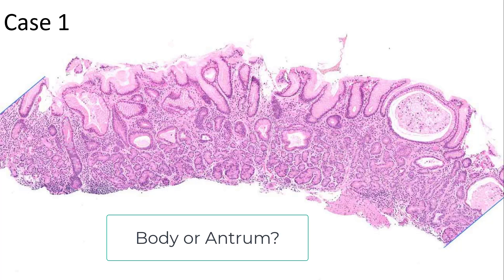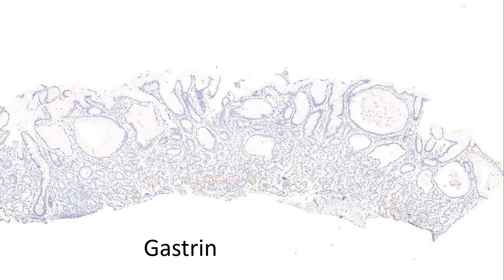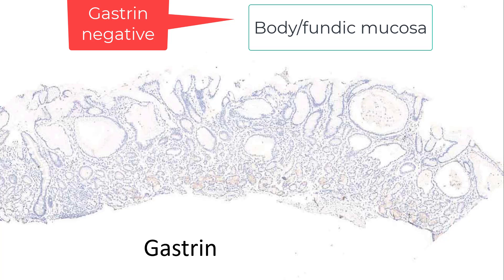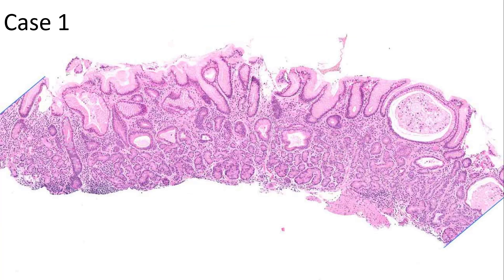Remember the mantra: in autoimmune gastritis, it's the body fundic mucosa that is messed up — the antrum looks quite normal. So how do you tell between body fundic mucosa and antrum mucosa? Here's the next best stain after sliced bread, and that stain is gastrin. Gastrin is positive in the antrum and essentially negative in the body fundic mucosa. This fragment is negative and therefore it is body fundic mucosa. So once we've decided it's body fundic mucosa, let's list out the features. It's gastric body fundic mucosa with chronic gastritis, superficial and deep.